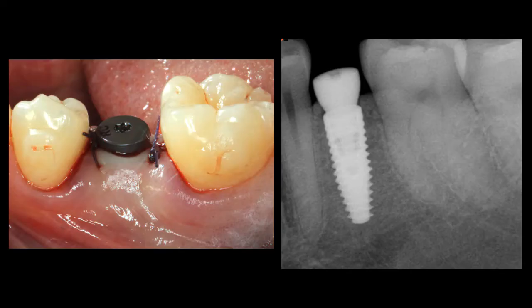Moving on, the final slide here shows the healing abutment in position because I had achieved adequate primary stability, over 35 Newton centimeters. Again, different practitioners have different numbers they go by, and different implant systems have different numbers. In this particular case, we took a radiograph, and this is a Straumann BLT, bone level taper.